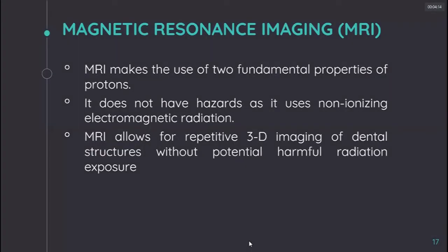Magnetic resonance imaging, also known as MRI. MRI makes use of two fundamental properties of protons. It does not have a hazard as it uses non-ionizing electromagnetic radiation. MRI allows for repetitive 3D images of dental structures without potentially harmful radiation exposure.